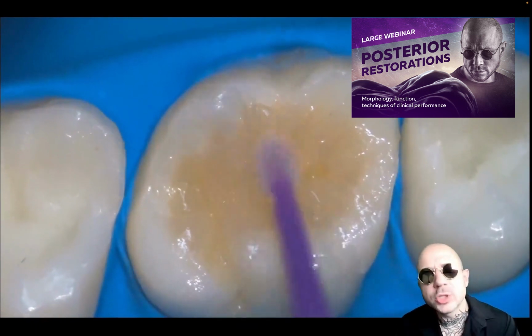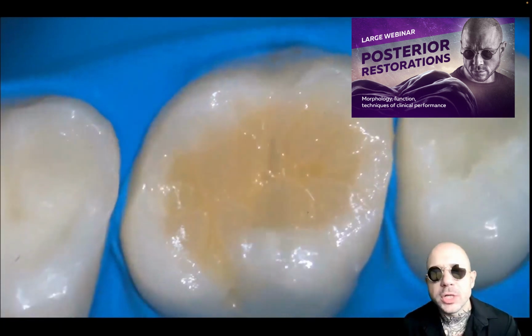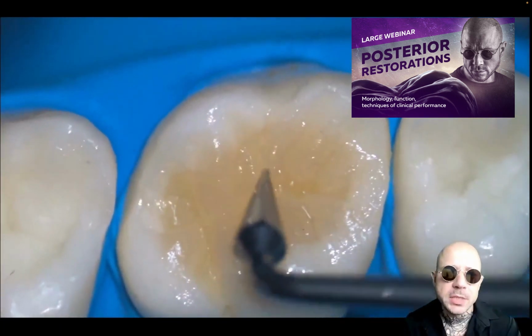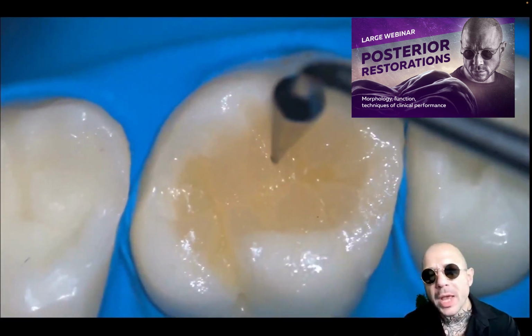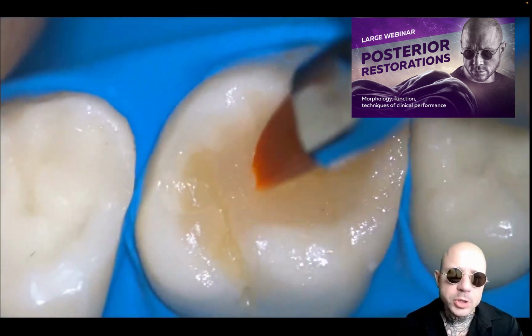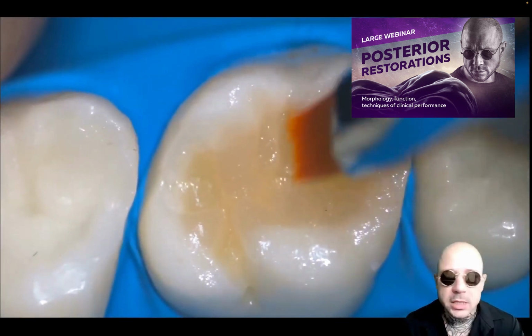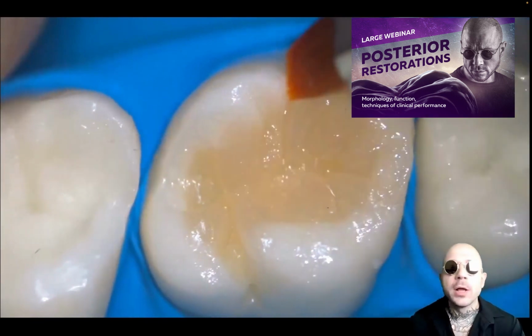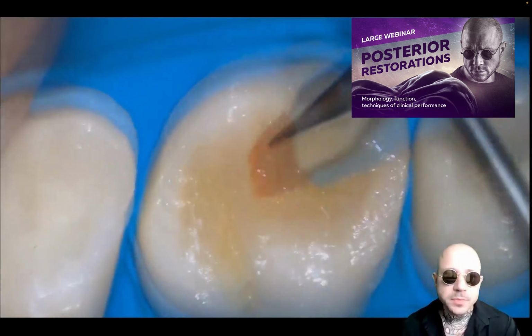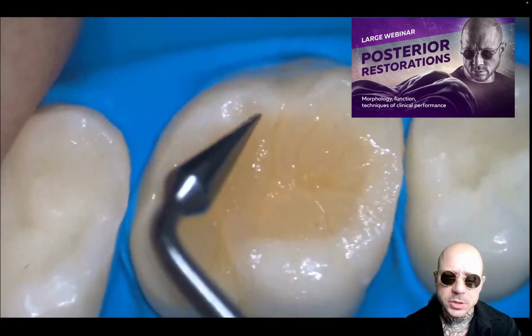That's why a paintbrush may be more useful in such areas. Not only a big one, we also have a small one. We produce small brushes which are angled and very convenient for adjusting the elements in case of posterior restorations.